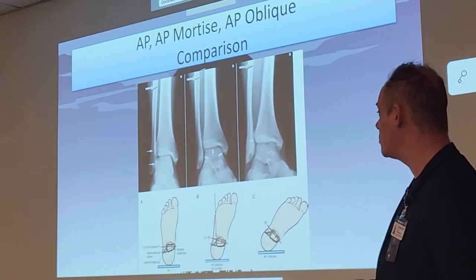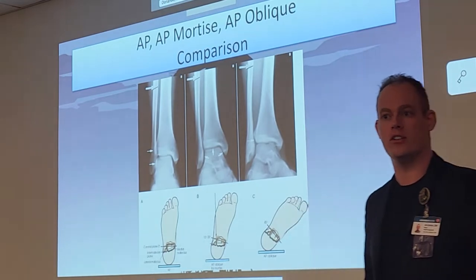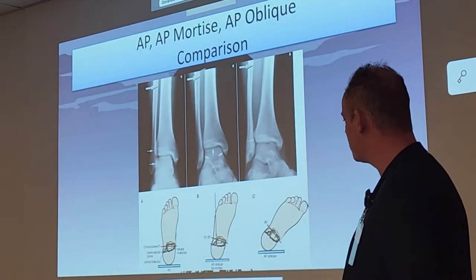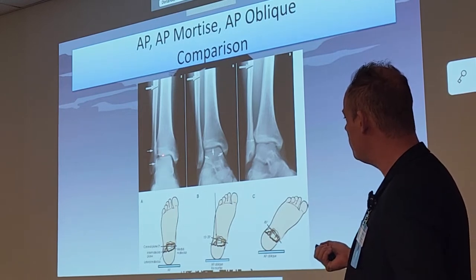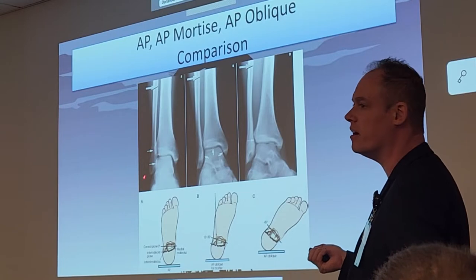Can you see the clear distinction between those three images? Can you deduce what view we're doing on each one, what position? What are the clear indications? For the AP, we can see the superior and medial section of this joint, but this is completely closed off over here.